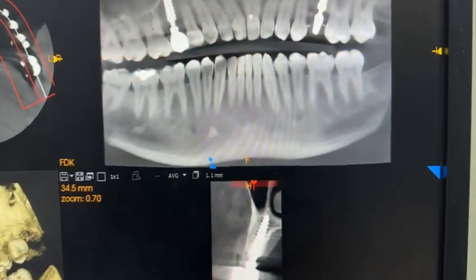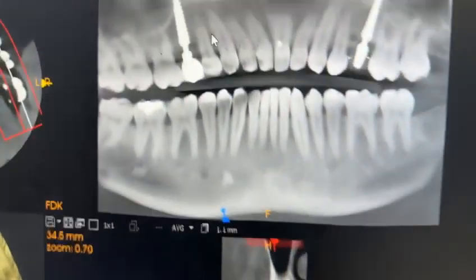You can see the right side implant has been given a metal ceramic crown. It is completely healed buccally. The bone is fully formed. There is no crestal bone loss, no peri-implantitis. The result is stable.